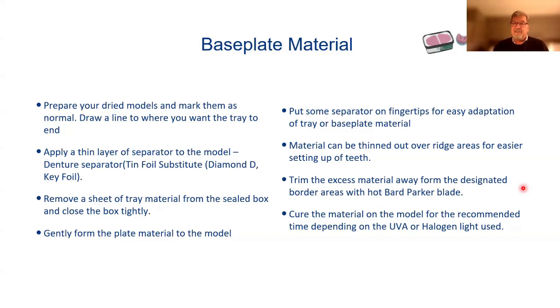I go as far as to even put a post dam in the upper model so that the patient really has suction with that base plate. And then I'm going to trim the excess with a Bard-Parker blade, cure it in a light curing unit, and then trim it again.